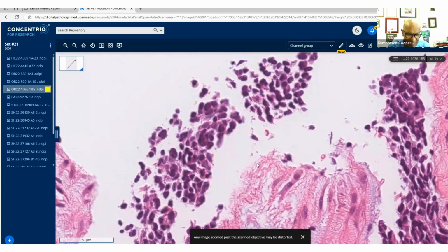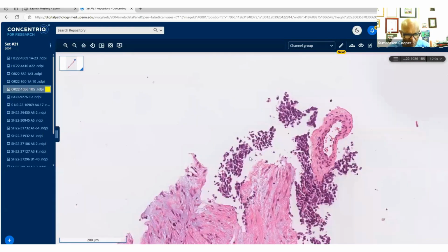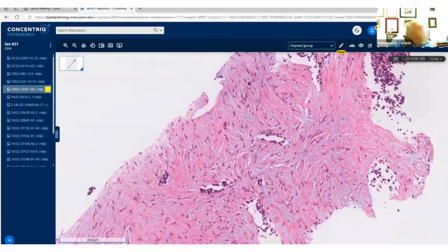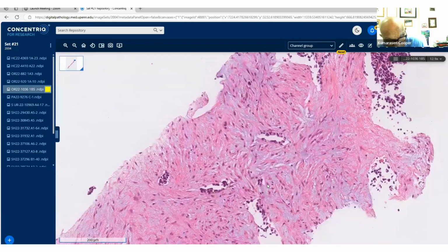And we looked at the immunohistochemistry, and we found 5 cells, literally 5 cells with focal desmin dot-like positivity. And we asked for the EWSR1 and it came back positive. Literally, so look very hard for those. My experience with that is the keratin was positive, but the immunoreactivity with desmin was what made us sure that it was a desmoplastic small round blue cell tumor. And lo and behold, the EWSR1 came back positive. So that's very useful. So agreed, Janet.